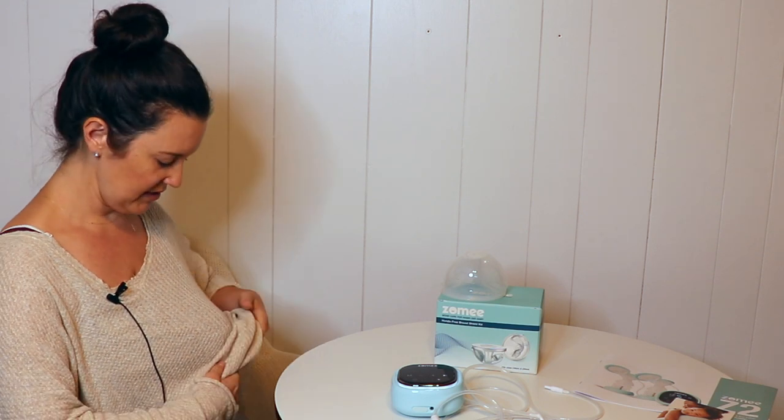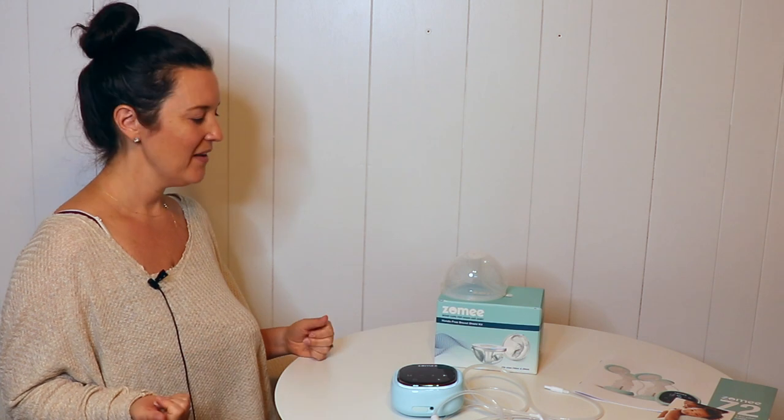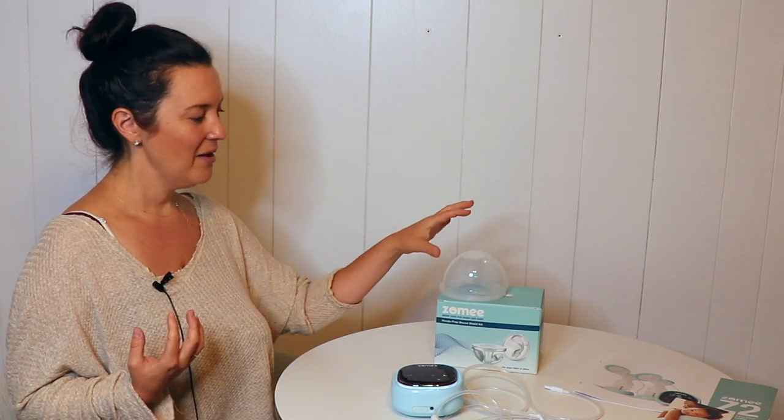As you can see I am wearing a pretty baggy shirt right now. I do have one of the collection cups on the left side and nothing on the right side. So it's not totally unnoticeable if you were to be wearing a tighter shirt. You can notice that you're wearing this, but if you have it in your bra and you have a nice loose top on, people are less likely to notice it. If you're at your desk pumping it could be more comfortable than having the bottles attached to you. When I was using this I did find that the suction was a little bit less intense with the cup versus the flange from the bottles.